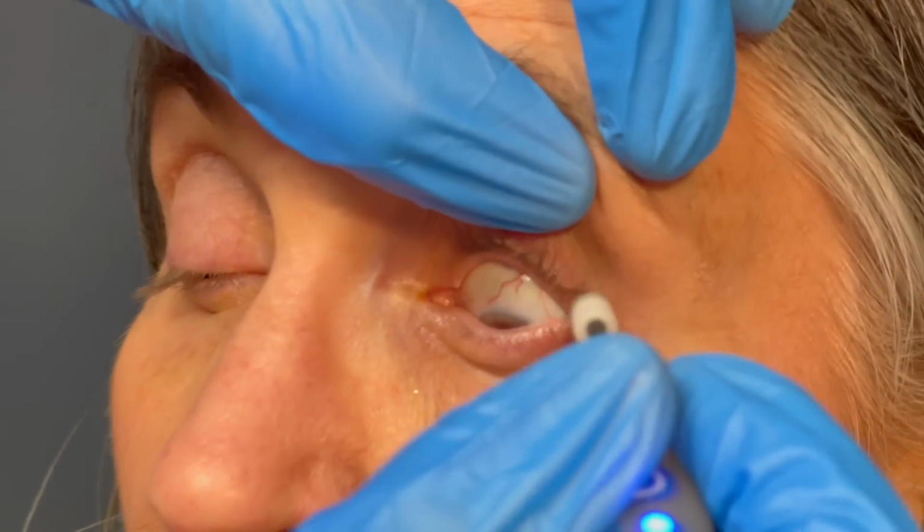The nice thing about this instrument is that it goes both clockwise and counterclockwise. And when I press this little button, it just tells it which direction to go, clockwise or counterclockwise. Now we'll do the last eyelid. So just look down toward your toes for me. You just keep looking down as best you can.